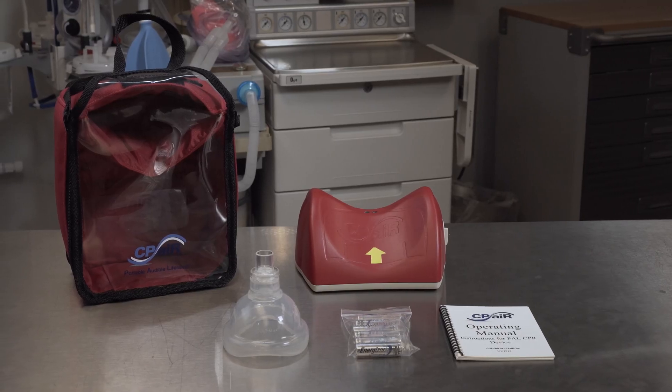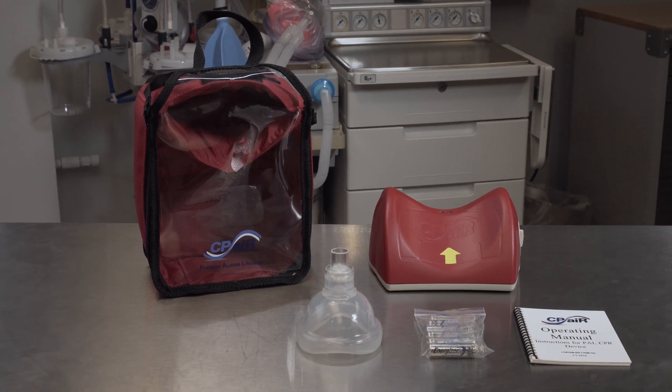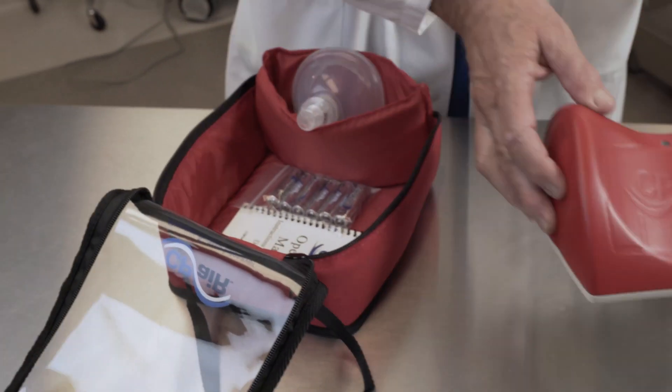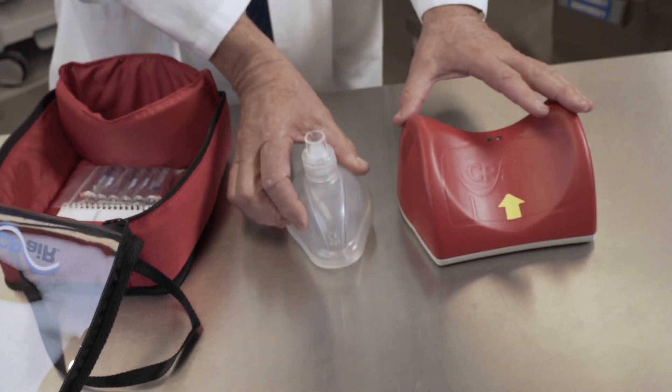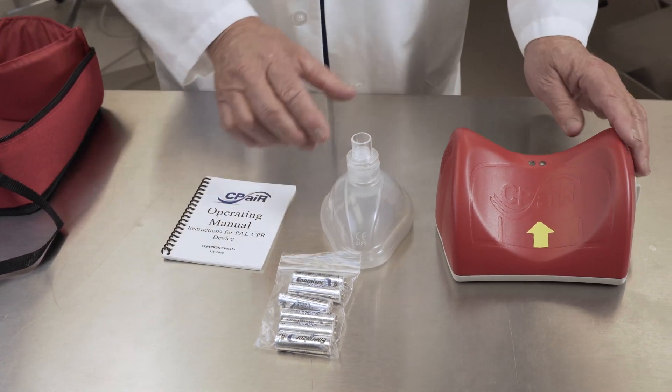When you receive your PAL, it will contain everything you need to perform quality CPR: long-lasting AA batteries, a mouth-to-face respiratory mask with biofilter to prevent disease transfer, a water-resistant full-color operating manual, and the patented water-resistant electronic PAL.